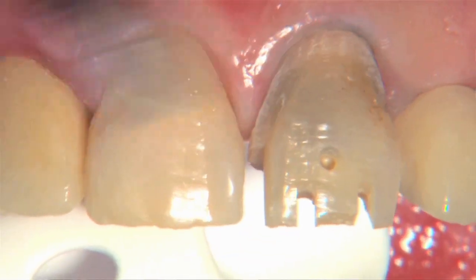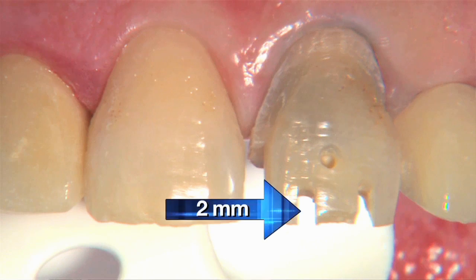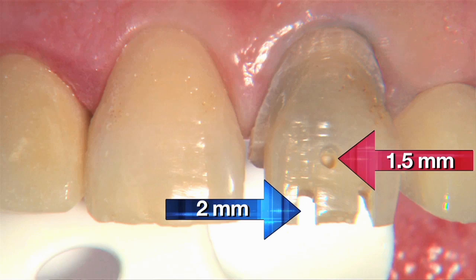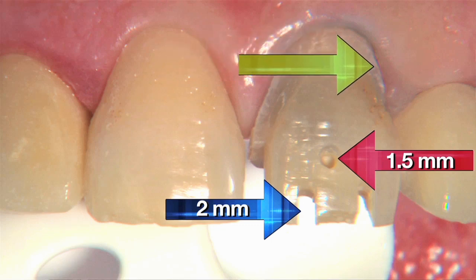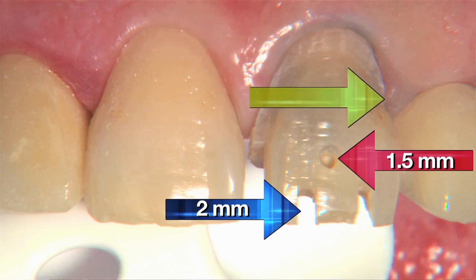And so now we have our depth cuts. We've got 2 millimeters at the incisal edge. We've got a 1.5 millimeter axial depth cut. And then we have 1 millimeter of reduction that's been done in the gingival third, and our margin's essentially in the right place because we've already retracted the tissue vertically by placing that double zero cord in place. And we're also going to use that round bur on the lingual for the margin formation there as well.